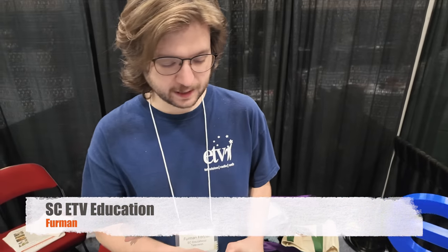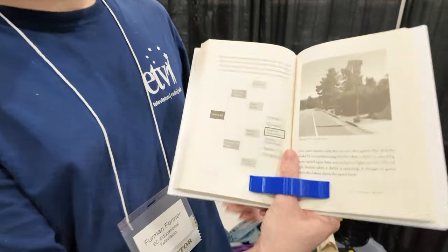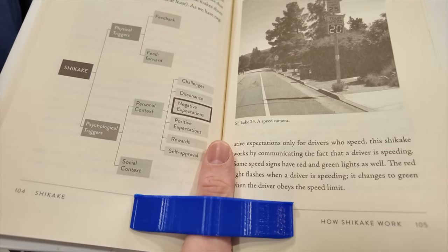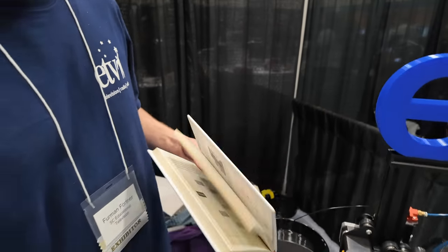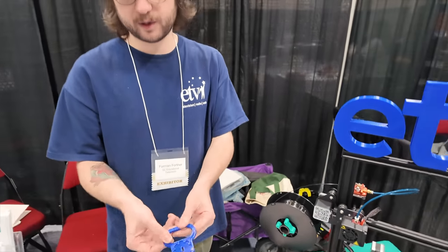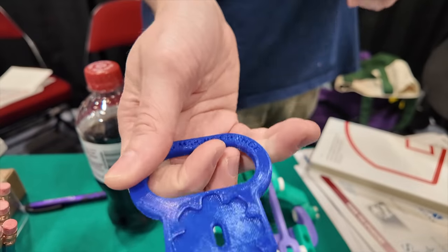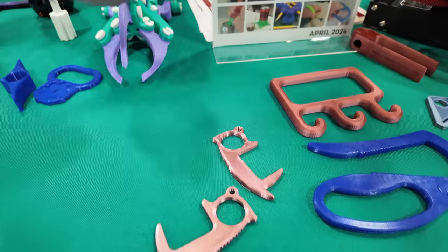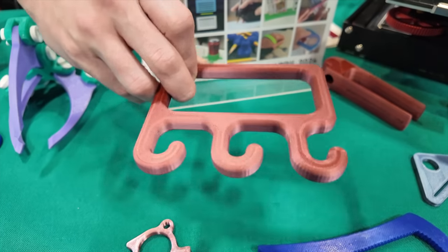I know. Hi, I'm Furman Fortner. I work for SCETV Education. I'm here displaying some of the 3D objects we'll have available on Know It All in April. This is a one-handed book holder that I can use to hold open a book like that. There's also line readers and stuff that go out for books. We have a key turner that we can mount a key into and then use it to help turn. Button pushers and door grabbers, bag assist or carrying assist for when you're carrying groceries.